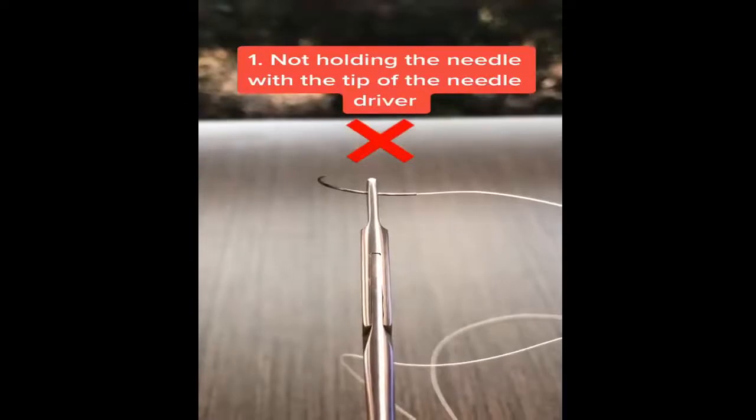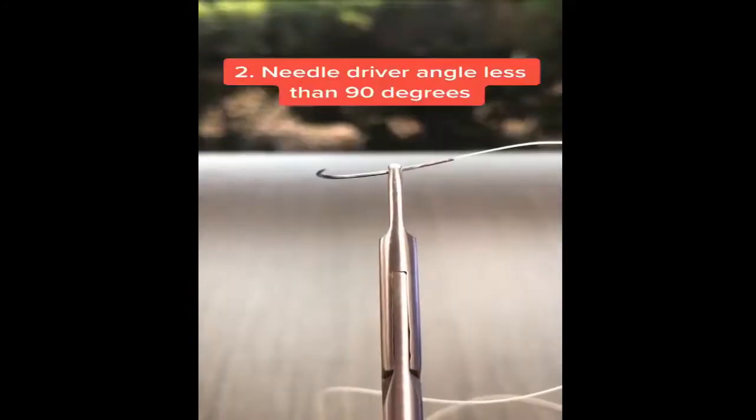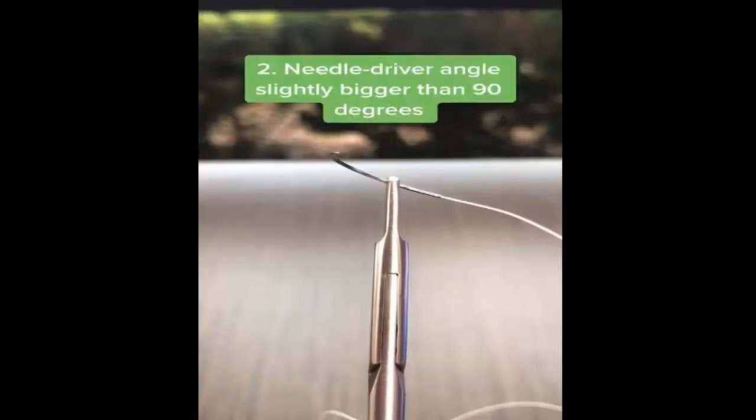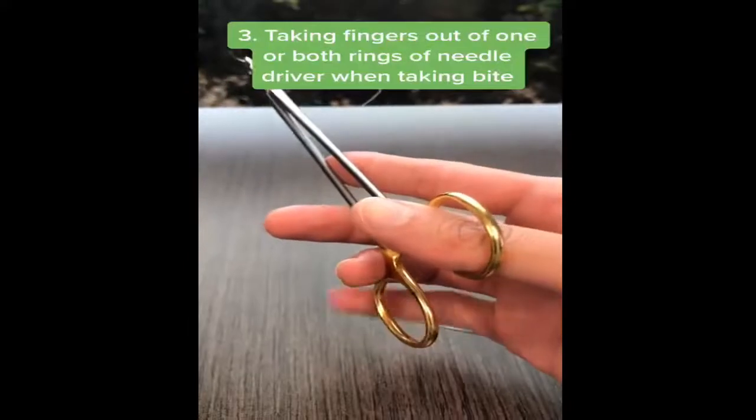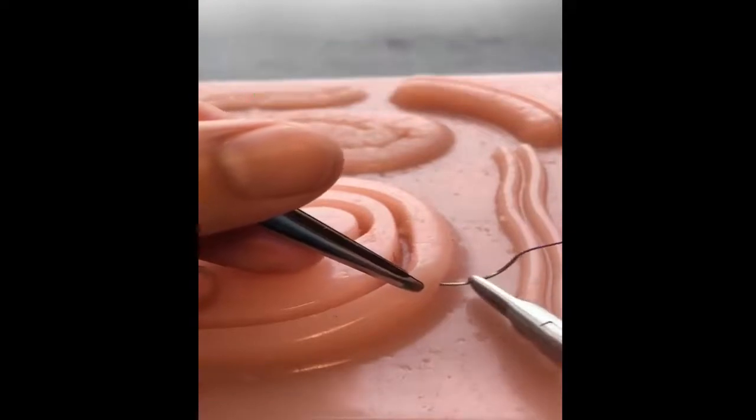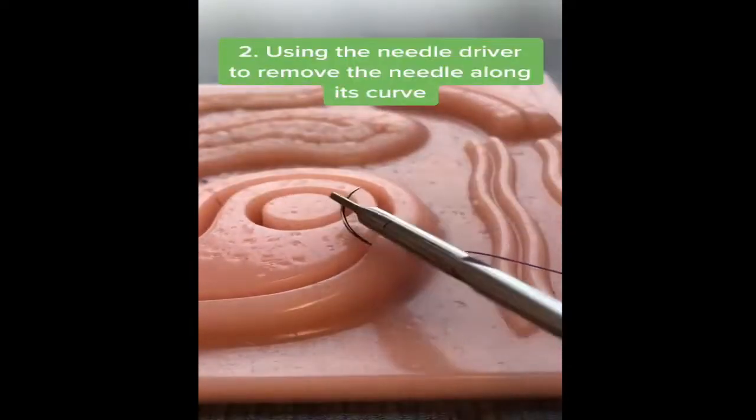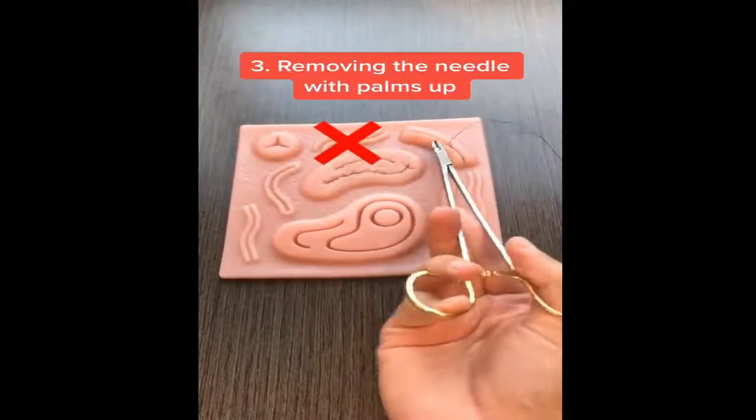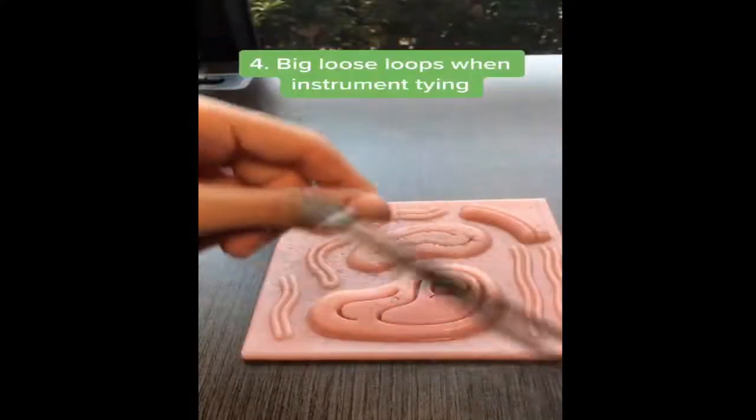Here are visual examples: there—nope. Yep. Nope. Yep, nope. Nope. Yep. Nope. Yep, yep, yep, yep.